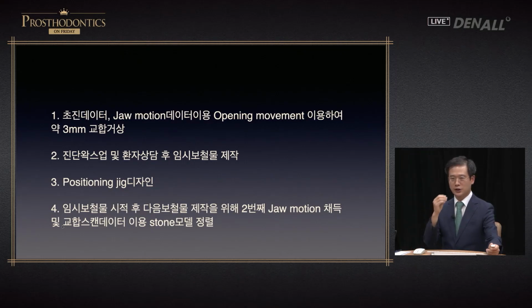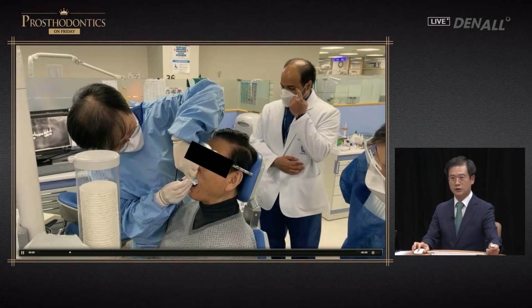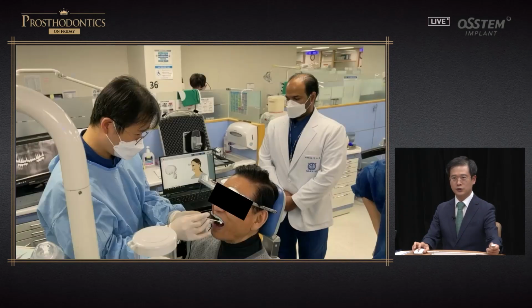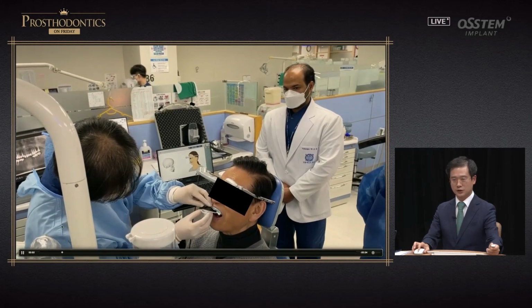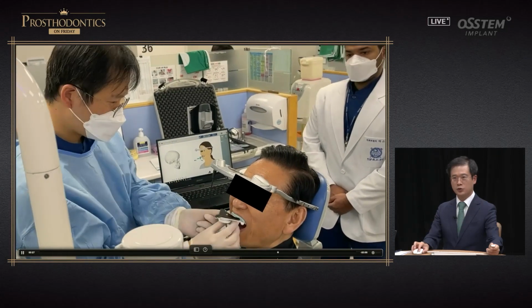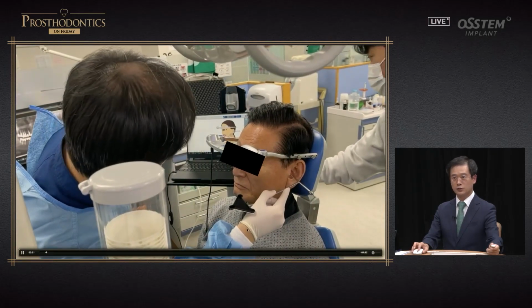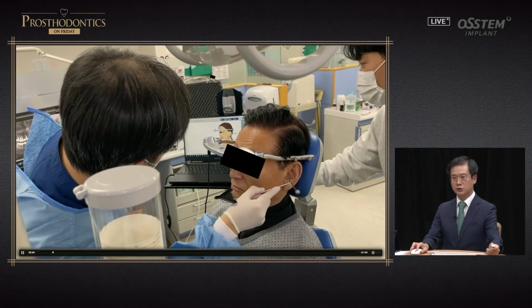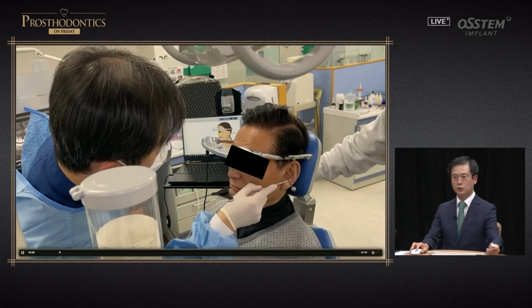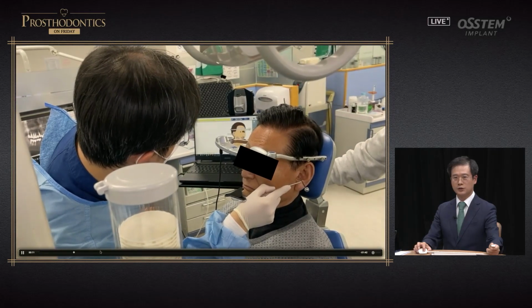I recorded the mandibular movement and jaw motion, and this was reflected on the final prosthesis. In order to do face bow transfer in the upper and lower, putty was used and records were made. The upper and lower positions have been recorded. After that, on the left and right, I record the position of the ear. On the articulator, the information data is set. Lower jaw movement is recorded.